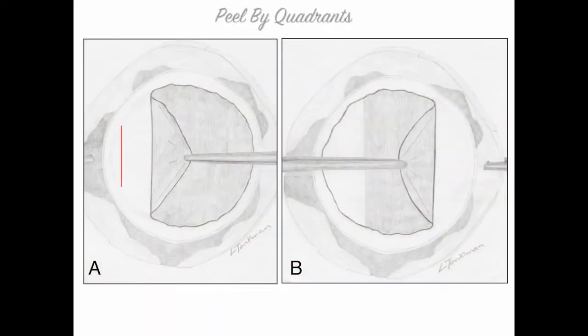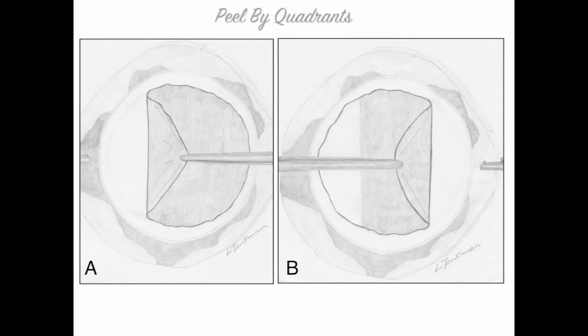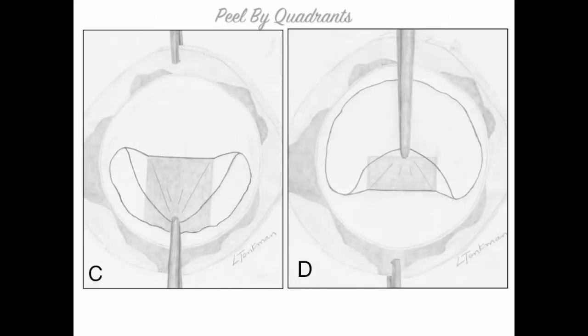I peel in a specific order. The wider the peel zone gets, the more tension there is on the tissue. Therefore, the first two peels I only take halfway to the center, so there's less likelihood of a tear. After these first two peels, a narrow corridor of unpeeled tissue remains. The peel zone can get no wider than this corridor, so I can peel it all the way to the center with minimal likelihood of tears.